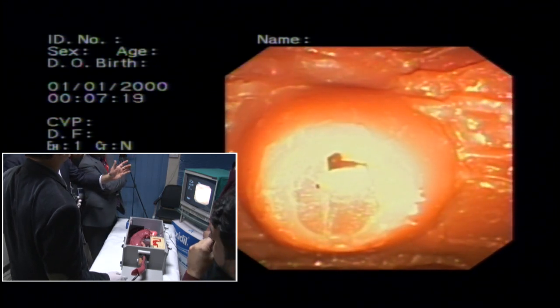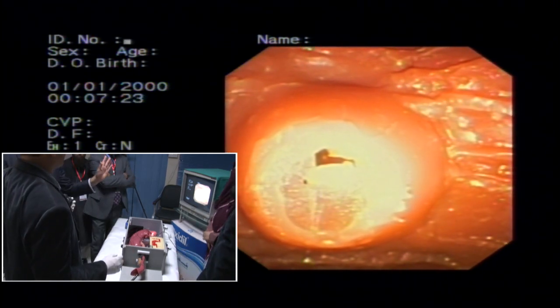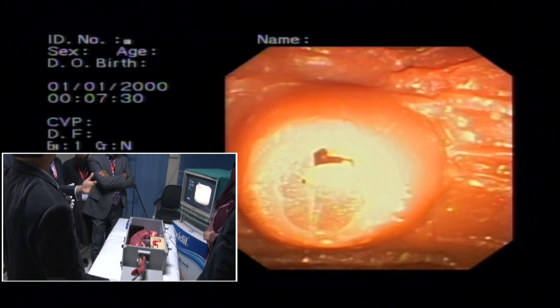Home in on the papilla. By the time you get to 60 centimeters, you should be fast with the papilla. Usually 60 centimeter is the right distance. थोड़ा सा बाज वक्त 55 पे भी हो जाता है, लेकिन if you are at 60, you should be okay.